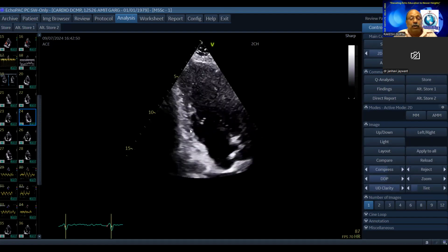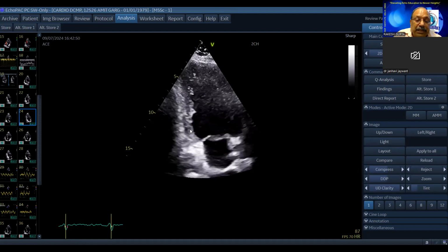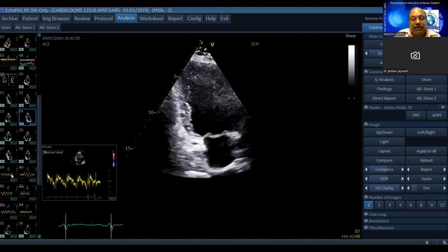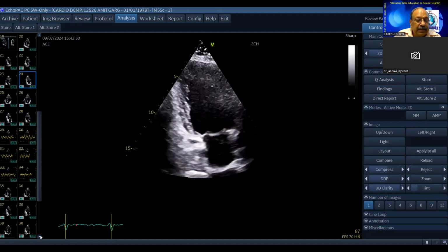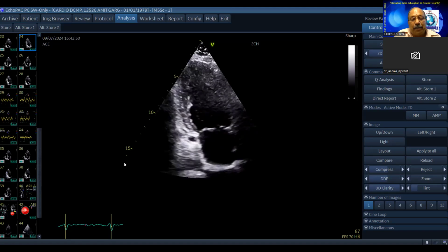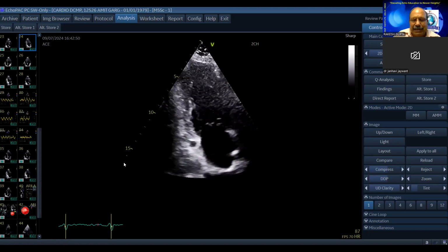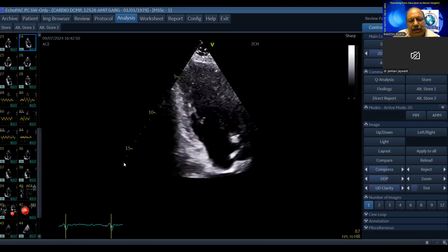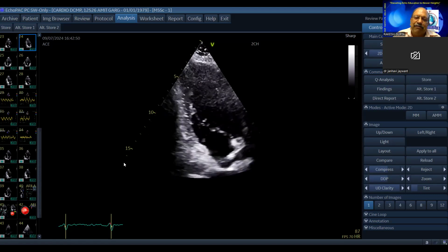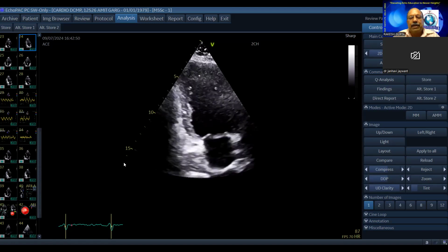So one of the ways to differentiate between ischemic versus dilated cardiomyopathy is to look for tissue Doppler imaging velocities. Second is clinical evaluation. Like you optimize these people because the treatment will remain the same. You optimize these people, you start finding wall thickening abnormalities. If there are no wall thickening abnormalities, possibly you are dealing with DCM. If you find a wall thickening abnormality, as in this patient, this is ischemic cardiomyopathy.